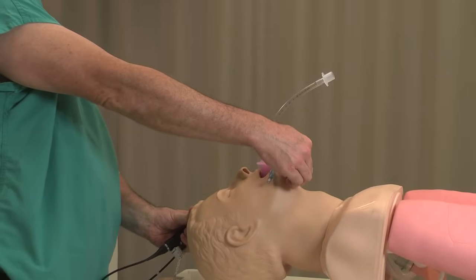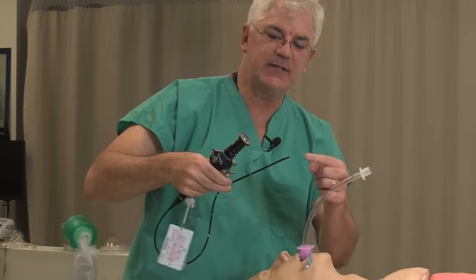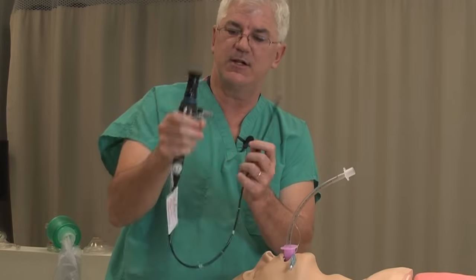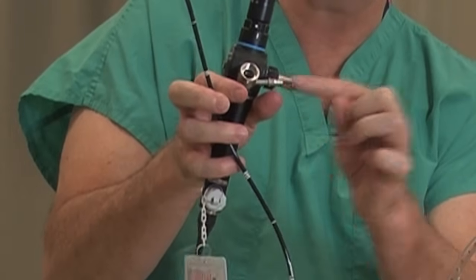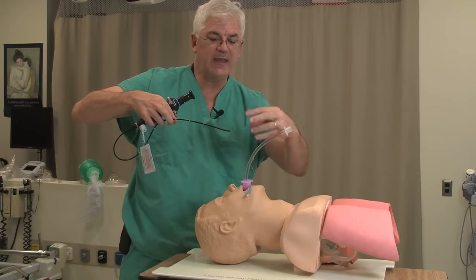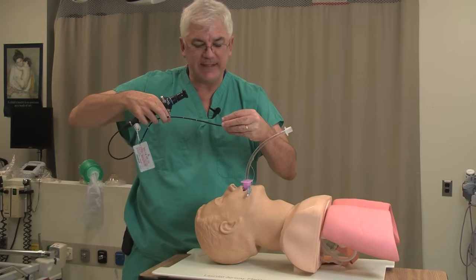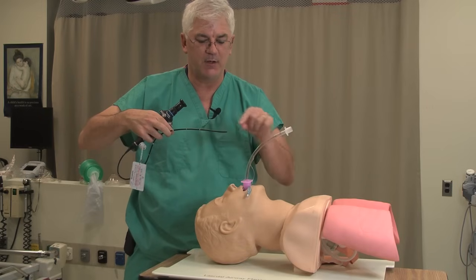This is when it's good to have an assistant lift the jaw — that keeps things nice and firm and right in the middle. I have to anticipate that I might run into secretions or blood getting in my way. Should I attach suction? No. What I do is attach oxygen so it's blowing in and will blow out this way. If anything gets in my way, the oxygen will blow it out of the way rather than suction, which would basically stick against the end of the fiber optic and block my view. So I hook up oxygen.